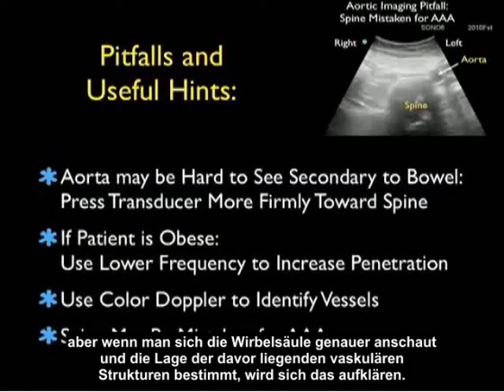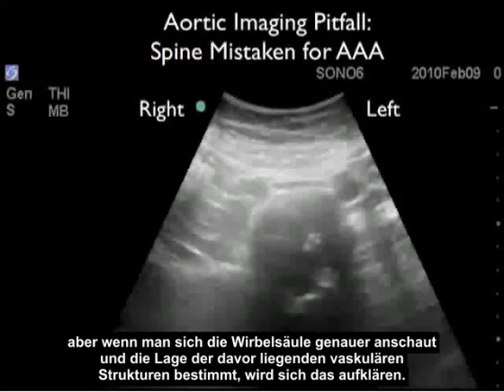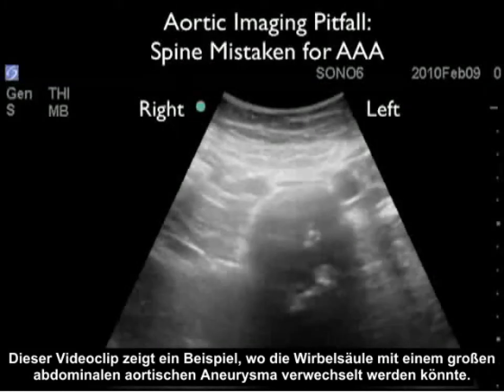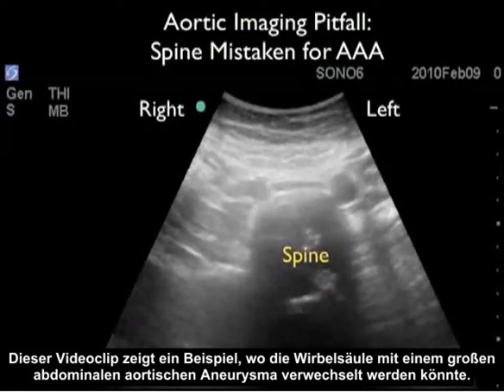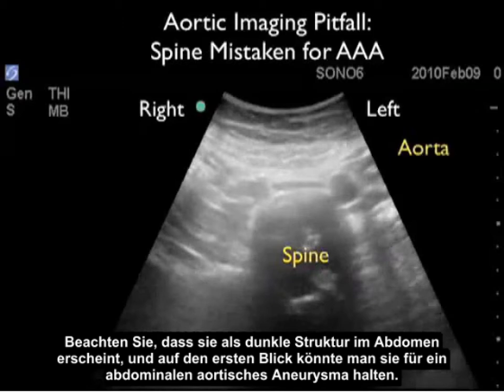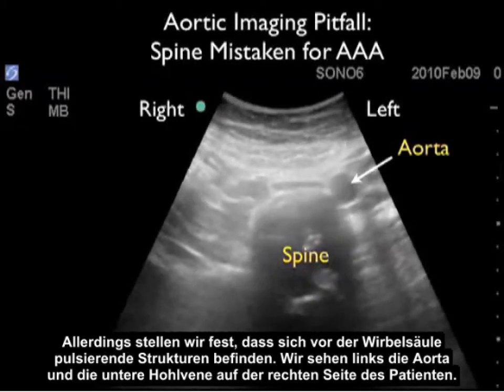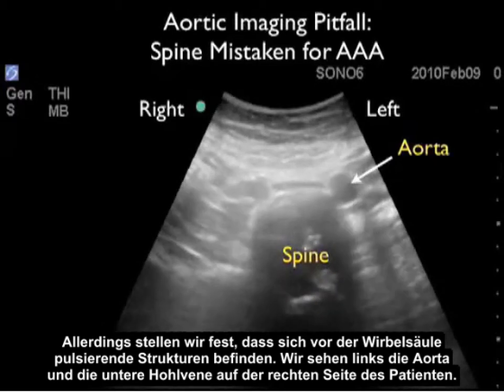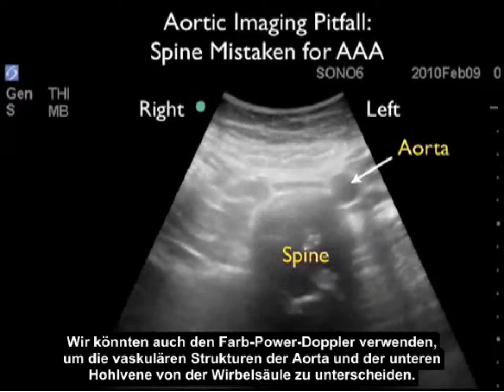This video clip shows an example where the spine could be mistaken as a large abdominal aortic aneurysm. Notice that it has the appearance of a dark structure within the abdomen, and at first glance it could look like a AAA. However, we note that there are pulsatile structures anterior to the spine — we see the aorta to the left and the IVC towards the patient's right side. We can also use color power Doppler to differentiate the vascular structures of the aorta and IVC versus the spine.